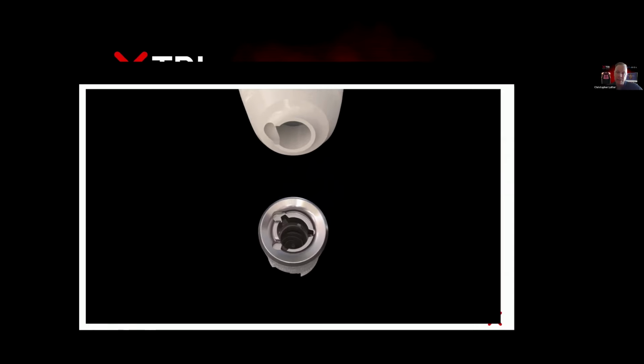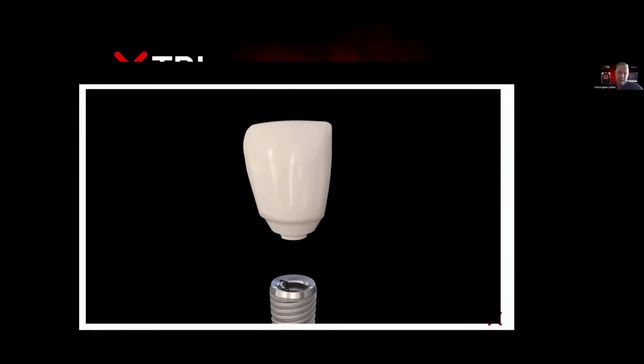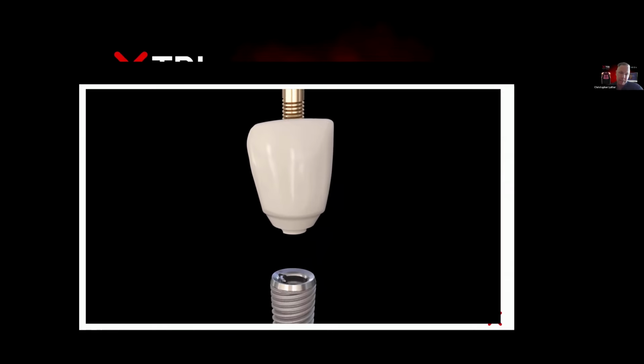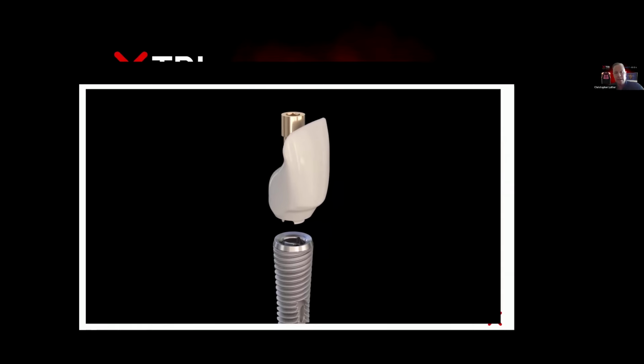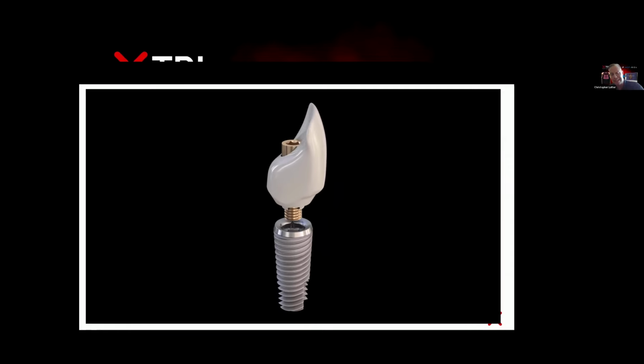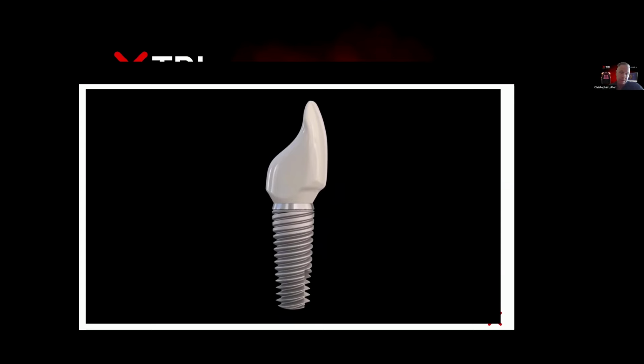This is a 20-degree beveled conical connection type implant that is indexed here and timed on a single unit restoration that is reverse engineered at the interface, polished zirconia on a titanium base, and this bolt screw locks in seamlessly, torqued to 35 Newton centimeters, obviously for optimal aesthetics.